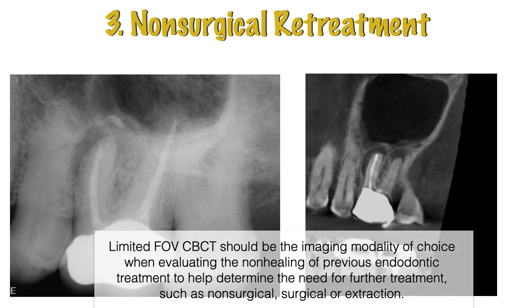So the same thing here with the CBCT, we can clearly see that there is a wraparound lesion here around the mesiobuccal root. The length was okay, so why is it failing like this, right? So we kind of have the J-shaped lesion here around the mesiobuccal root. We can clearly see the distal buccal root here that was not treated. You see the canal is empty. You also see the sinus. There's some thickening here of the sinus membrane, sinus floor membrane.